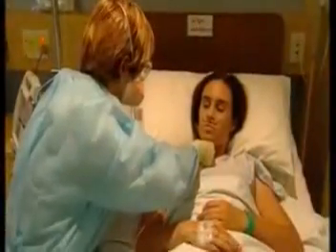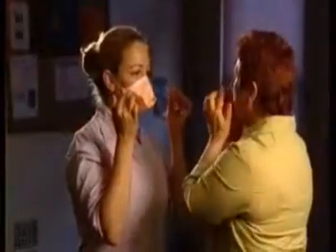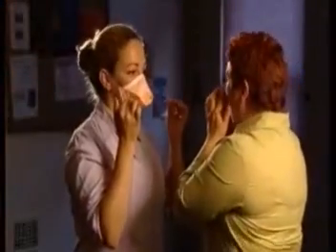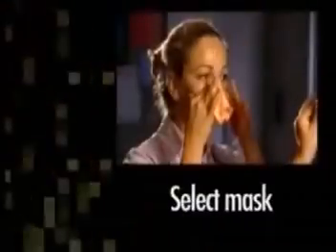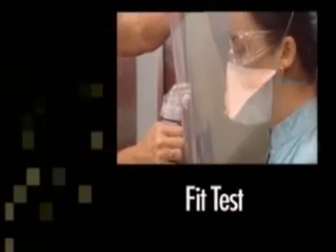In the event of an influenza pandemic, healthcare and other ancillary workers may be required to wear disposable high-filtration masks, such as P2 or N95 respirators. To ensure maximum safety and protection of the user, these masks must be selected to suit the individual's facial structure, put on correctly, successfully fit-checked, and fit-tested for the individual.